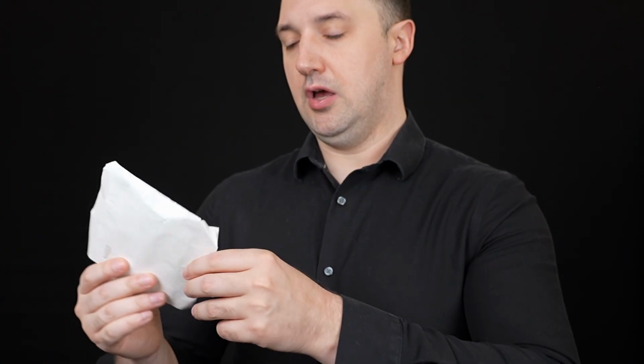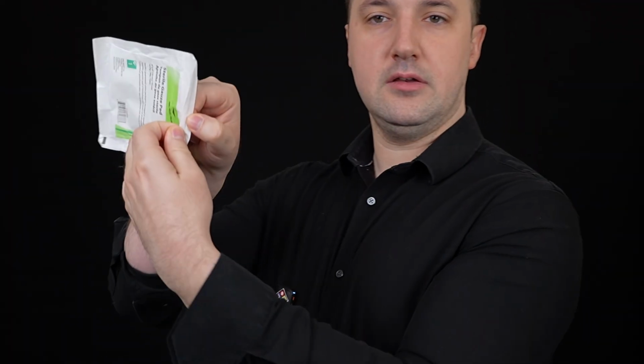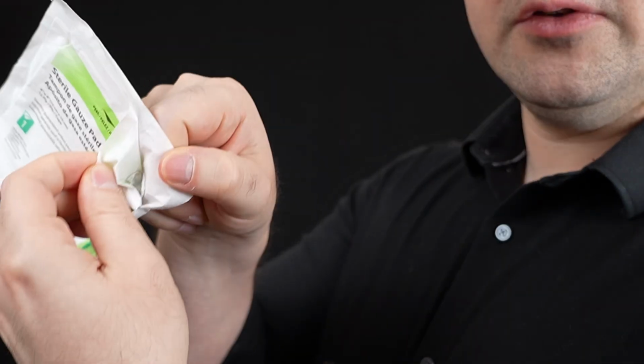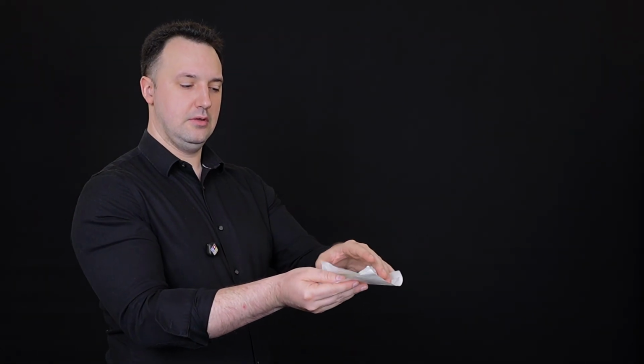Something that's sealed. Now, let's say you have a dressing in a package and you're trying to not make it dirty. There's usually an arrow on top of these that'll tell you where the top of it is. You can see here, there's a fold, right? You can grab the end of the corner on this and start peeling, and you can get inside of this dressing. You can open it up. Now, what you can ideally do is peel all this off. You have an open area.